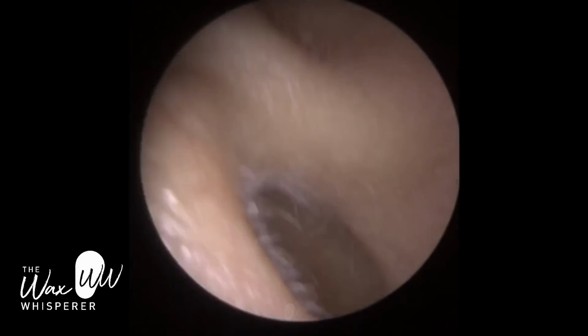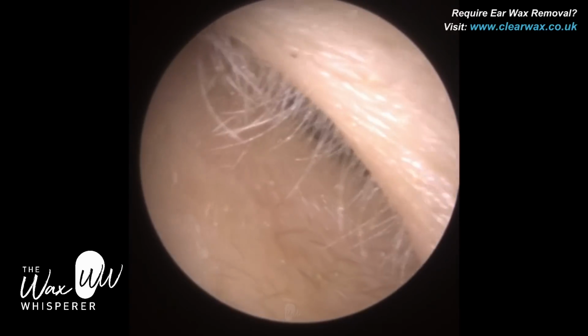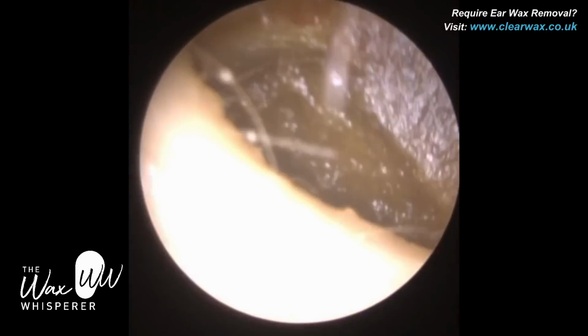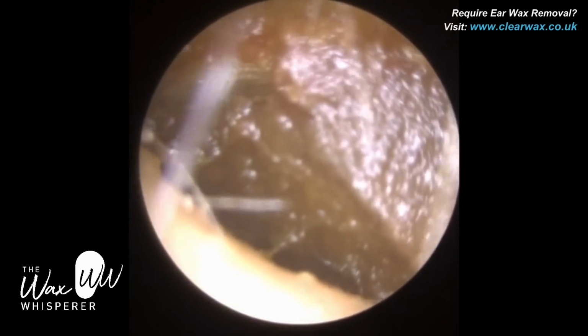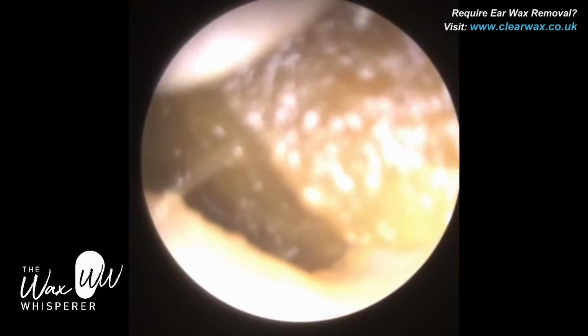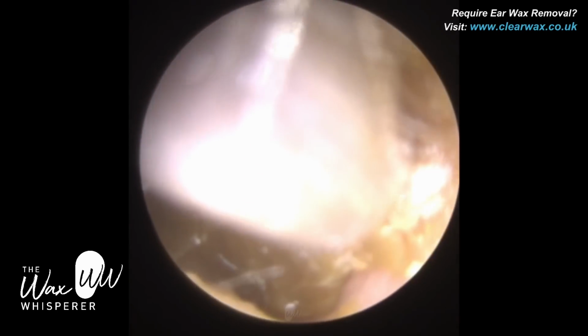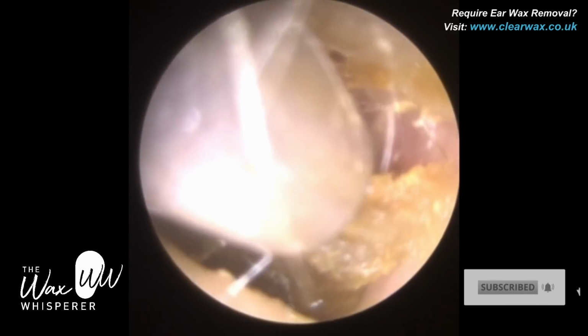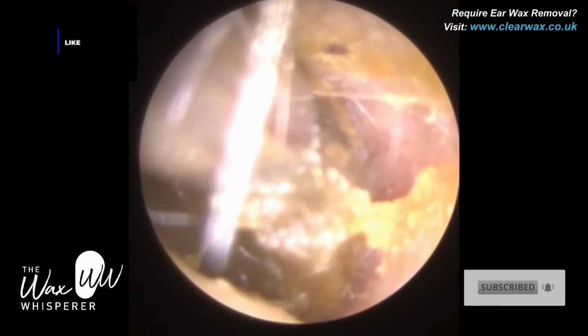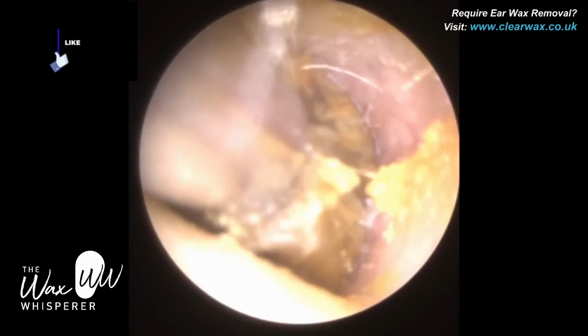So the patient attended with bilateral fully occluding earwax, and the interesting thing about this particular case was that the patient's ear canals, both of them, were very narrow, almost collapsed at the entrance, and very bendy and twisty. So whenever you've got a narrow, bendy ear, it's just a bit more difficult to get access into the ear.